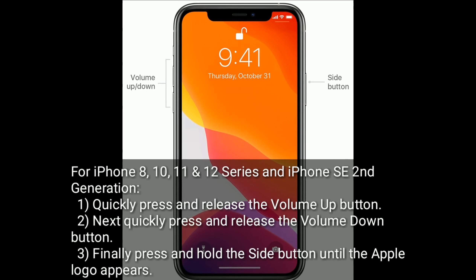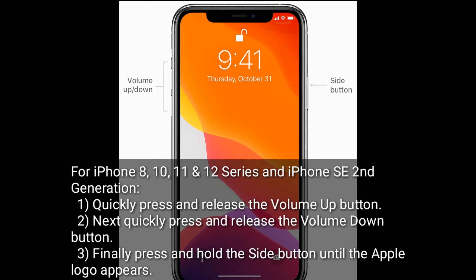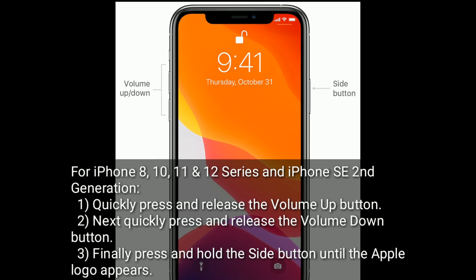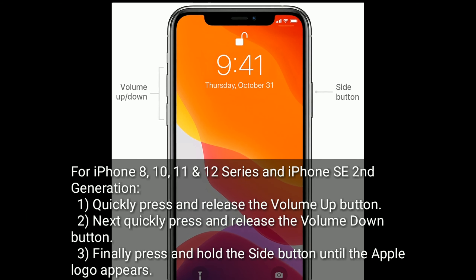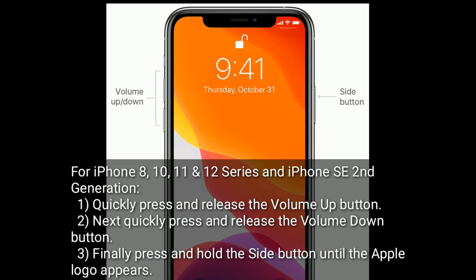For iPhone 8, 10, 11, and 12 series, and iPhone SE second generation: quickly press and release the volume up button, next quickly press and release the volume down button, then finally press and hold the side button until the Apple logo appears.